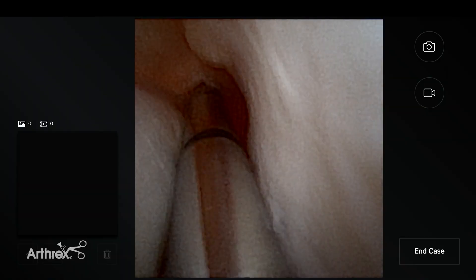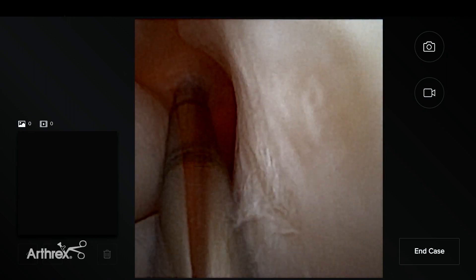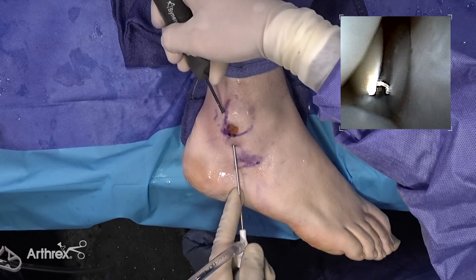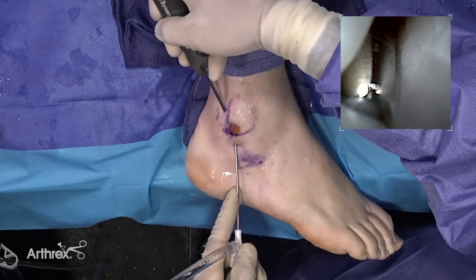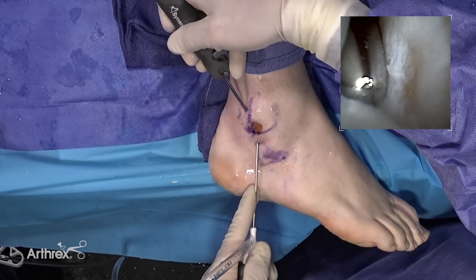Although in this case it is quite normal, we will simulate that there is a convexity in the posterior aspect of the fibula. We are going to demonstrate groove deepening using nanoscope instruments. I have a shaver in my right hand and I can perform groove deepening and debridement of any convexity at the tip of the fibula.